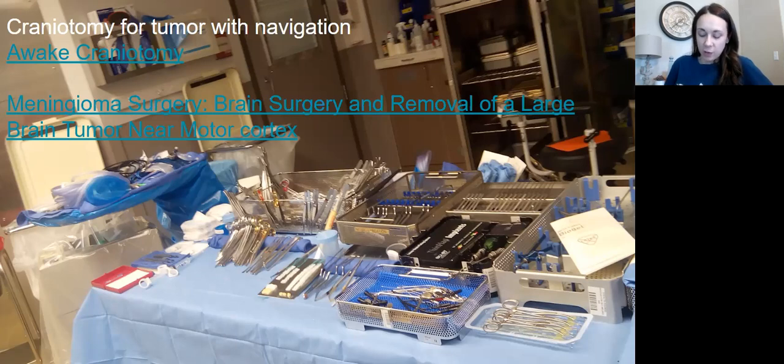So the ones that did use the retractors, I will say they would go ahead and bring the microscope up so they can really look at that brain tissue and decide where they want to put that brain retractor. So they still have the microscope first, but the next step, if they use a retractor, would be that Leyla or Greenberg retractor.